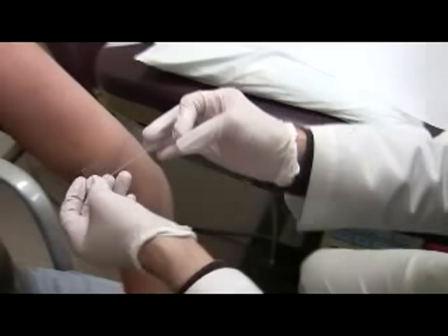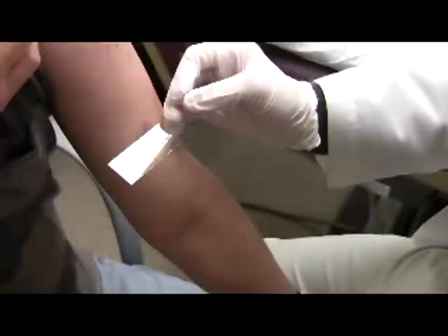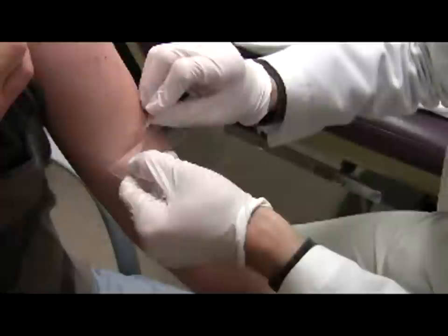You hold a glass slide with the edge of its long axis against the skin underneath where the scraping will be done. Take the edge of the short axis of another glass slide and scrape scale onto the first glass slide with a gentle rubbing motion. Blood should not be drawn.